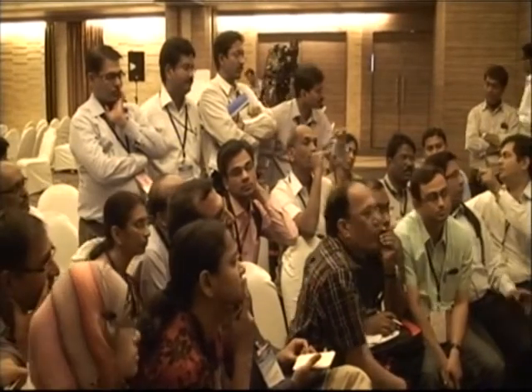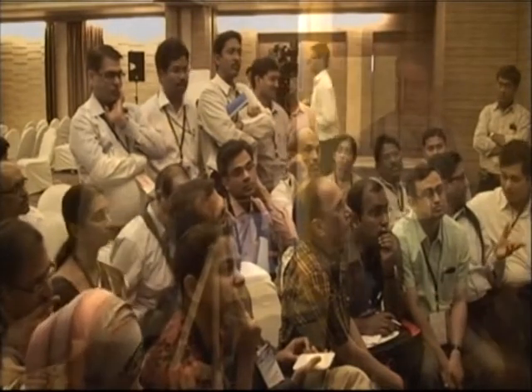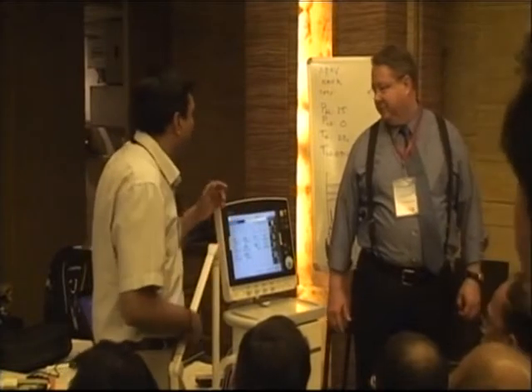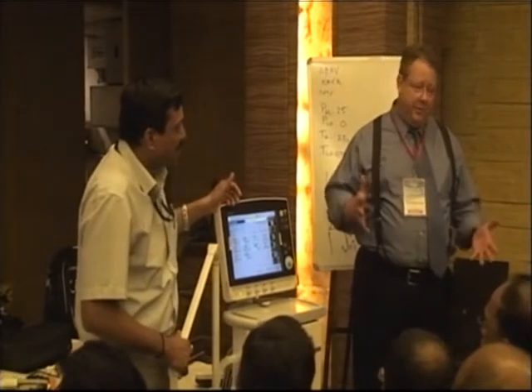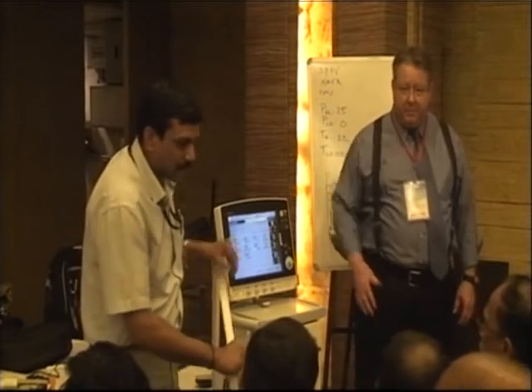We call this BiPAP on this machine. Another machine calls it APRV. It depends on what machine you're on. On the bi-level machine, we don't have that APRV name, so we cannot name it the same. But they're really the same modes. They just call them different things. Working-wise, you have to set them up a little differently sometimes as well, but the principle's the same.